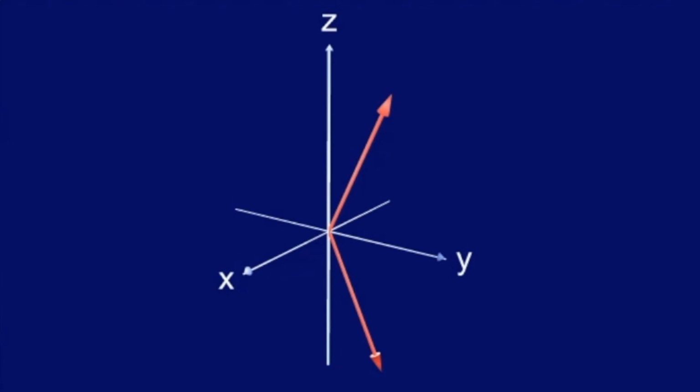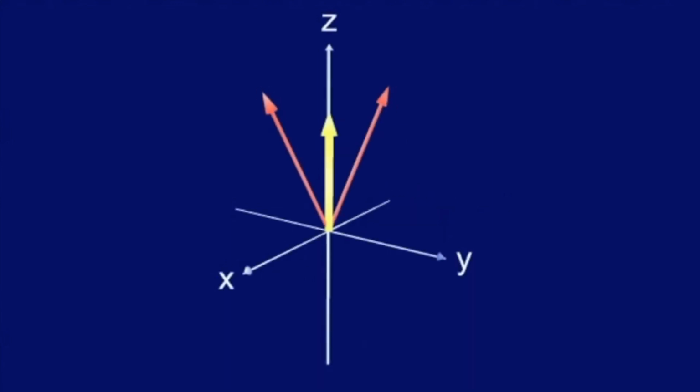But, as both protons are in phase, there is a new transversal magnetization which had not been there before. Try to imagine tilting a longitudinal magnetic vector 90 degrees to the side. Let's repeat that.